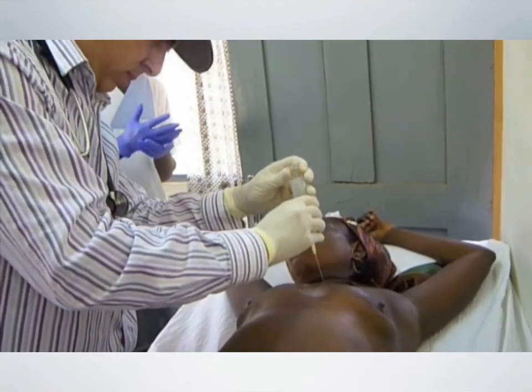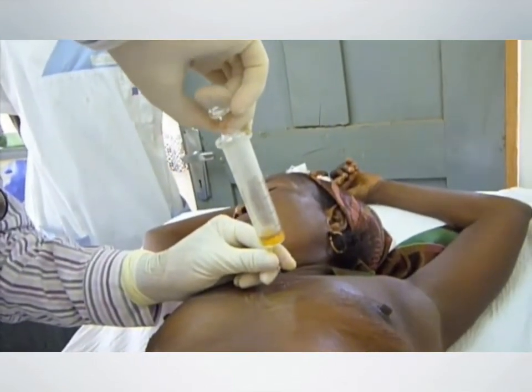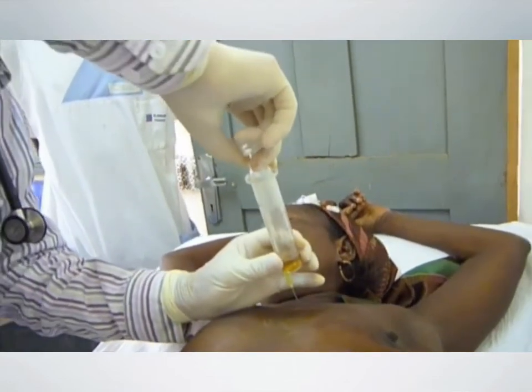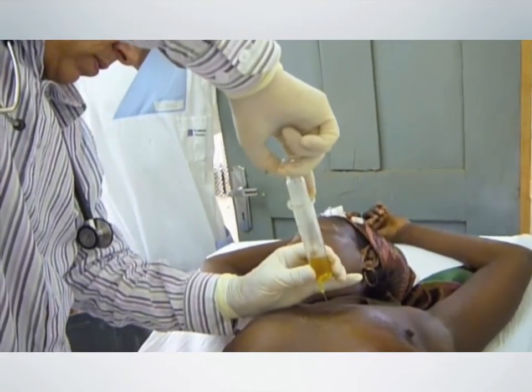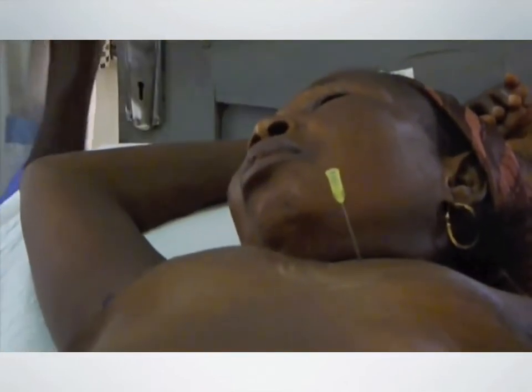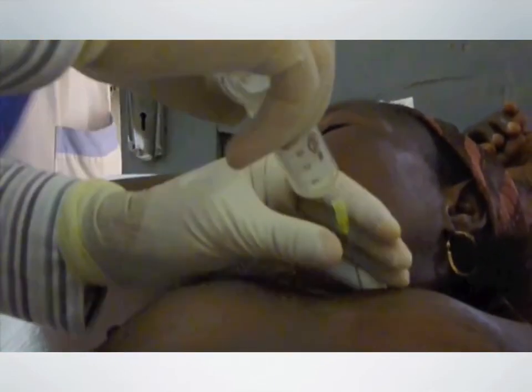It's important to note that this is in a very rural community, and the patient has no sedation, no xylocaine because it's not available, and in fact doesn't even have local anesthesia, but she's not in any pain whatsoever. The heart is quite superficial, and you can even see the needle bobbing next to the heart because you're in the pericardium and the pressure is being transmitted.